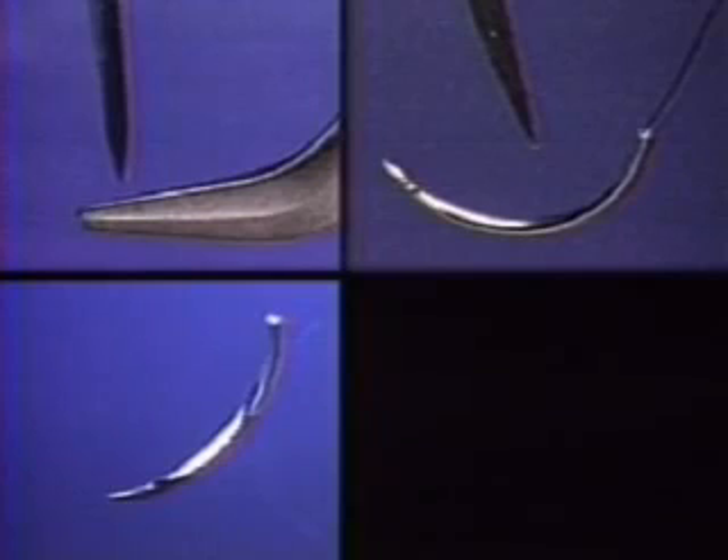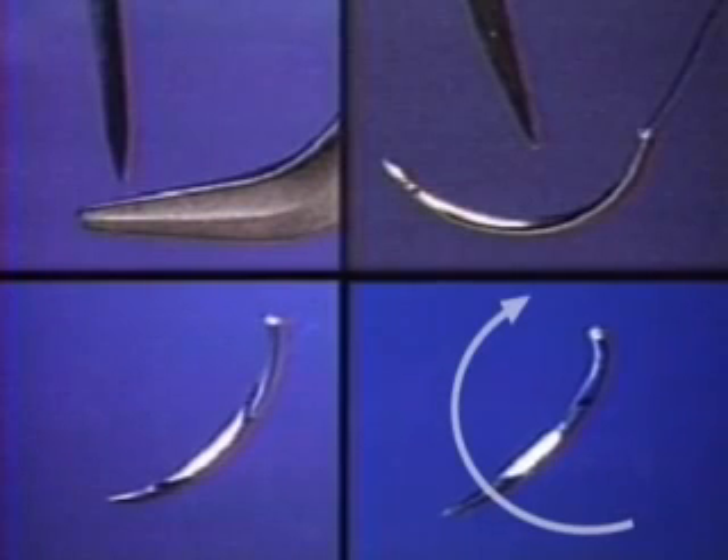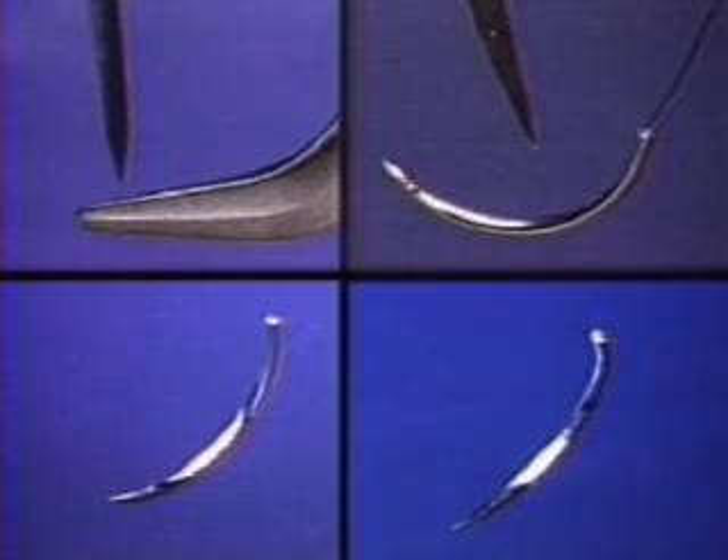Now let's get down to business. In the exact way that you pick up the needle, you set yourself up either for success or for frustration. There are four things — no less — that need to be just right each time. First, pick it up with the right part of the needle holder. Second, pick it up at the right point along its length. Third and fourth, the needle must sit at 90 degrees to the needle holder both in this plane and in this plane.